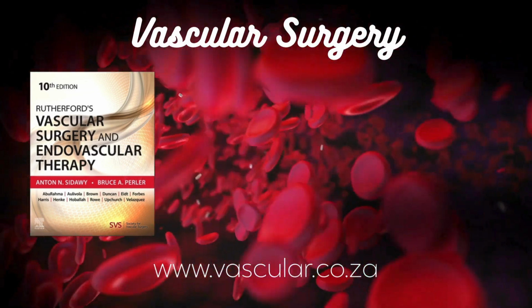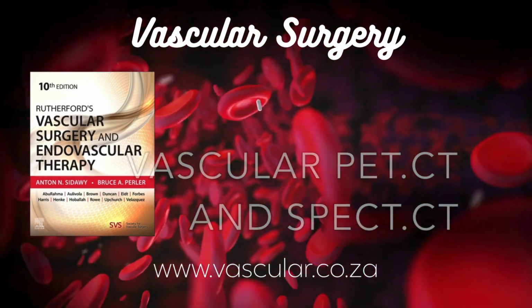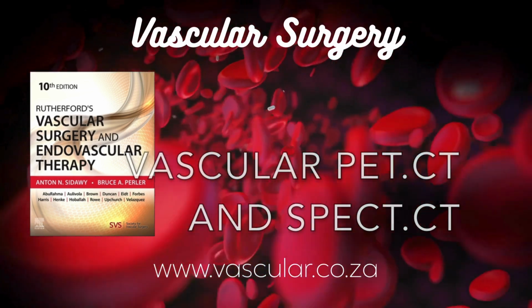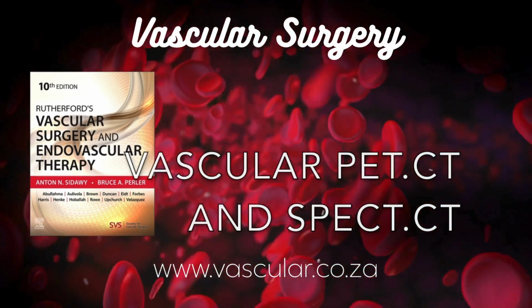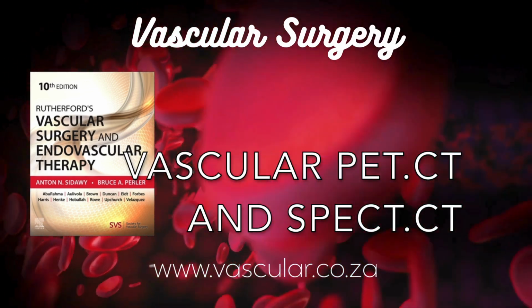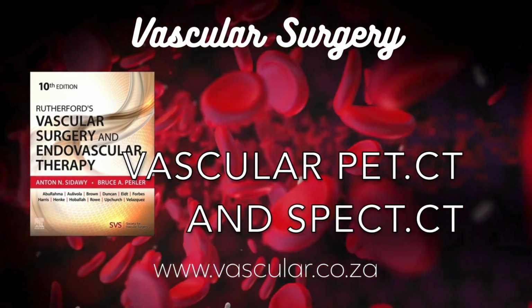Let's switch to large vessel vasculitis, things like GCA and Takayasu. Ah, yes. This is an area where FDG PET-CT has really made a big impact clinically. Why is it so useful here? Because in these conditions, the inflammation in the vessel walls often starts before you see significant structural changes like narrowing or thickening on traditional imaging.